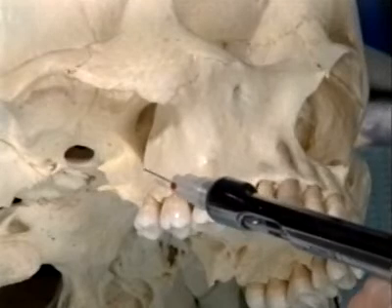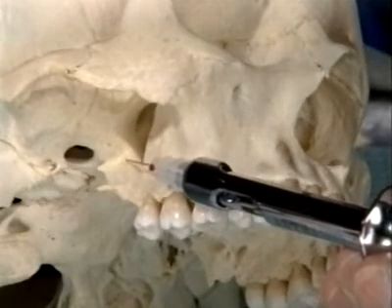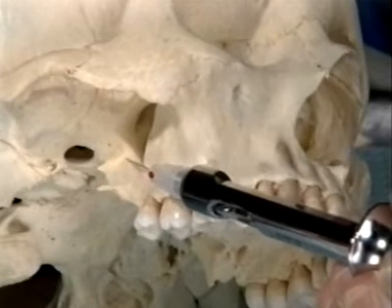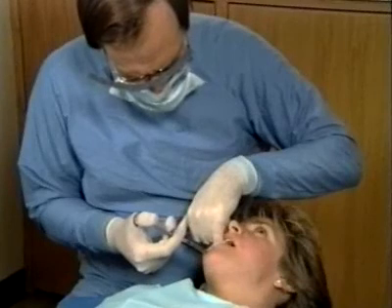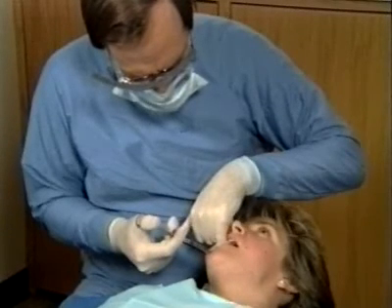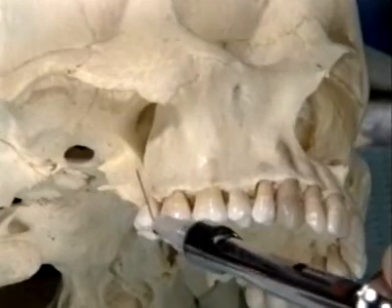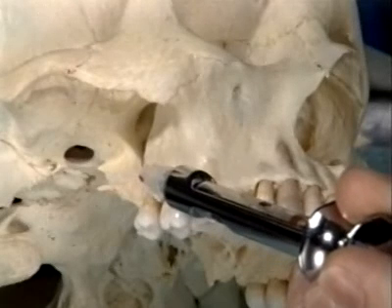A positive stop against bone near the final depth of insertion probably means that the needle has impinged on the pterygoid plate. In this case, the needle should be withdrawn slightly, a negative aspiration obtained, and the anesthetic solution injected. Anesthesia will often be obtained because of medial spread of the solution. If it is not, re-injection along a slightly more medial pathway can then be performed.